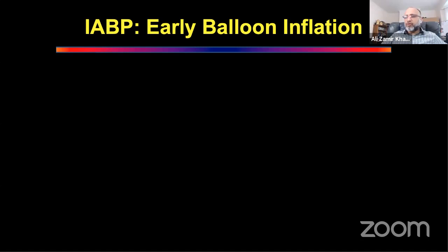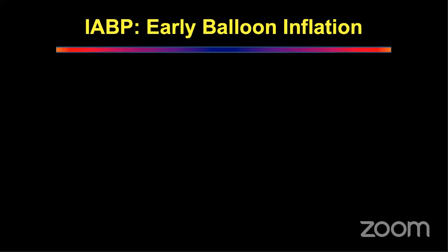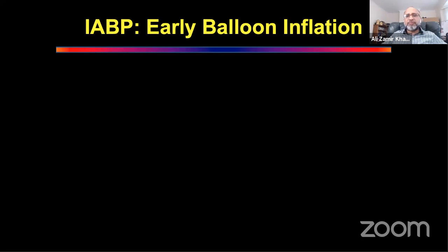Are you guys drawing or not drawing? Drawing, sir. What do you think will happen? And is it okay to have an early inflation of balloon pump? Anybody can take this question. Anybody wants to take the question? In late systole, the balloon pump is inflated. What is going to happen?